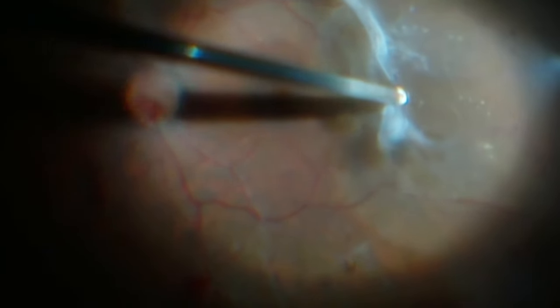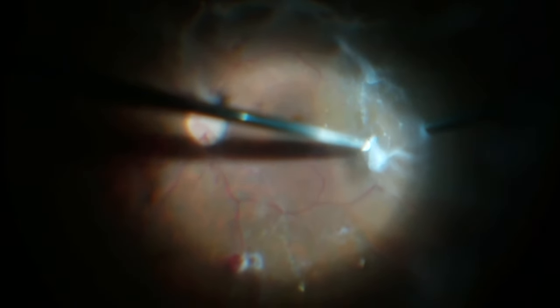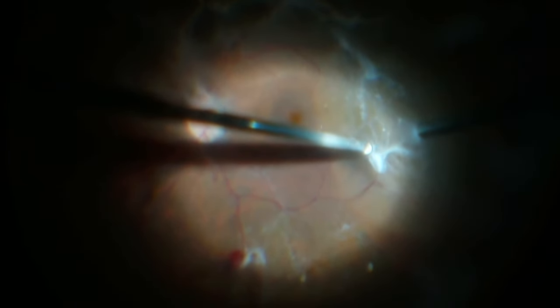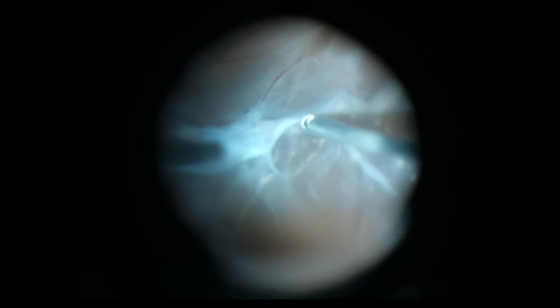The initial step for these surgeries is to remove as much traction as you can that's able to be removed safely with the vitrector. Sometimes you can do the entire case with the vitrectomy instrument, but sometimes the plaques are too densely adherent to the retina.